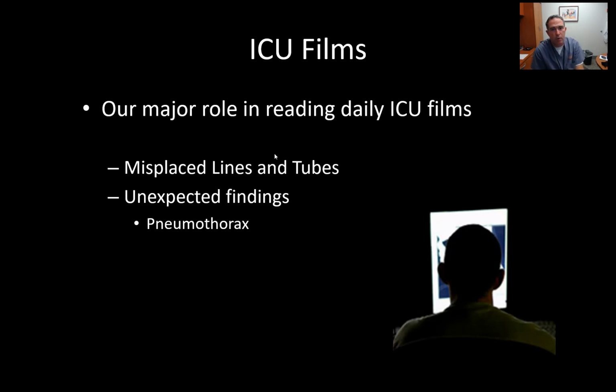So what is our role? Oftentimes there is a specific question: do they have an effusion? Do they have a pneumothorax? But for the dailies that do sneak through, it's about 100 or so a day, we are looking for misplaced lines and tubes. We're looking for unexpected findings, large effusion, significant pneumothorax, those types of things.